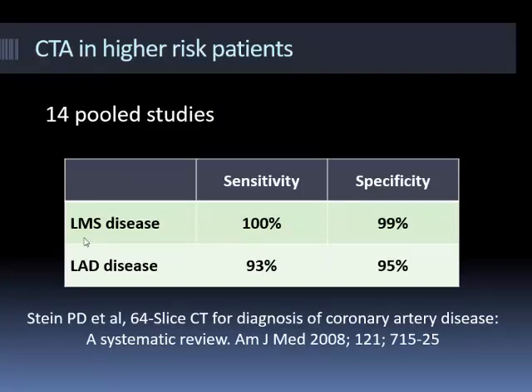high-risk patients. We often get patients who, for example, you think have got angina, but they're refusing invasive angiography. So there, what you're doing is effectively trying to identify groups of patients with potentially surgical disease as opposed to medical management disease. It's not ideal, but you can certainly use it.